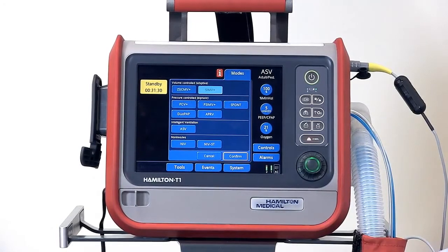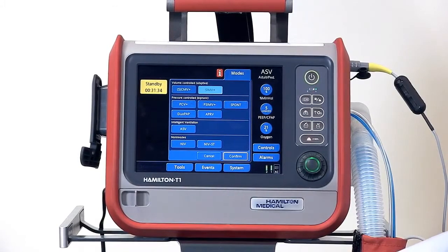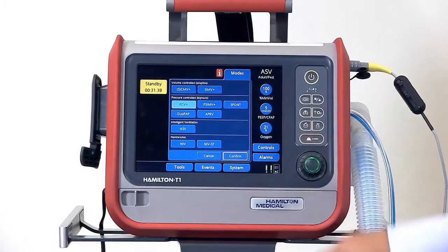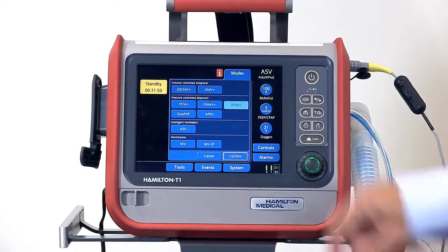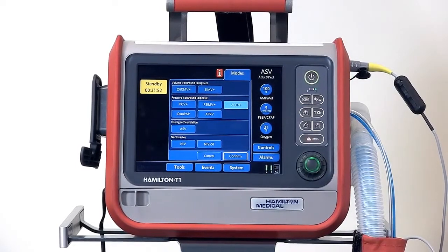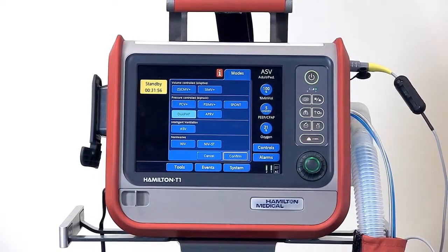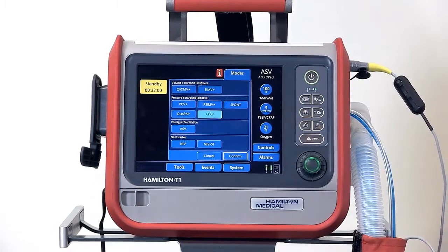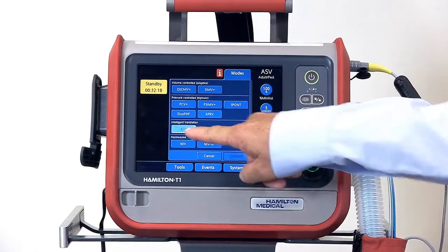In the next section, we have the pressure controlled biphasic modes, including pressure controlled ventilation, pressure controlled synchronized intermittent mandatory ventilation, spont mode for pressure support ventilation, dual PAP or dual positive airway pressure mode, and APRV — airway pressure release ventilation. Next, we have ASV mode, which is adaptive support ventilation.